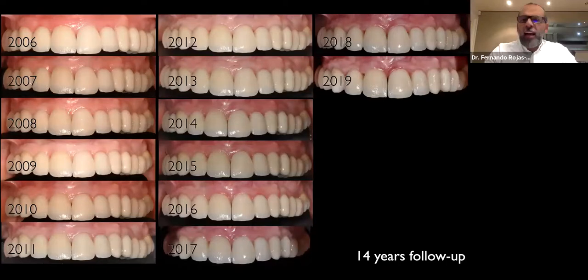I can see that after 10, 12 years, in this type of cases, when I make a segmentation, because I place implants for fixed partial dentures in central to canine and first premolar to first molar, I can see a small gap between the two centrals, but this is after more than 10 years. It's probably because the head is still growing like 2 millimeters every 10 years. So it just creates a small gap. This is why I like now a splint restoration. But this is a 14-year follow-up.